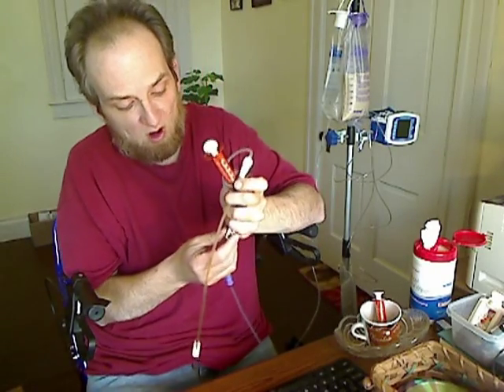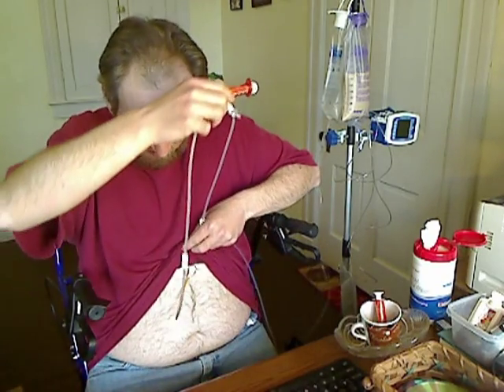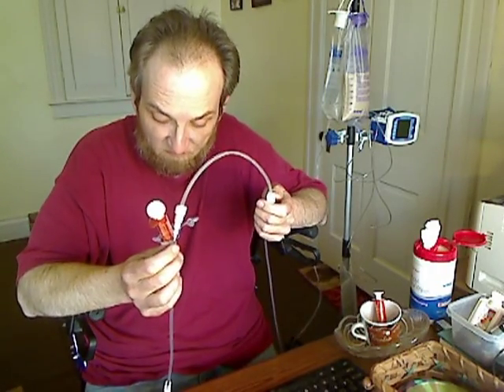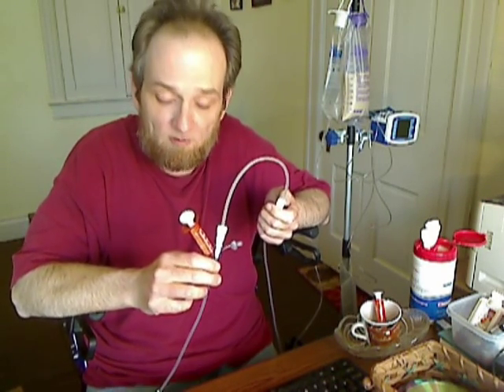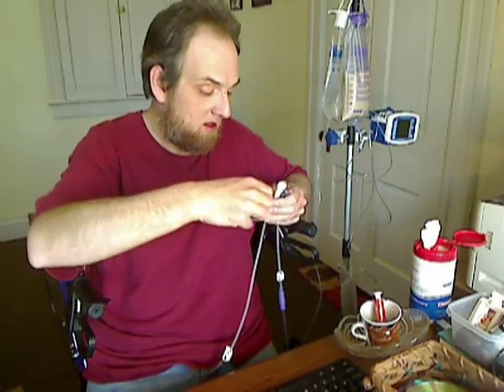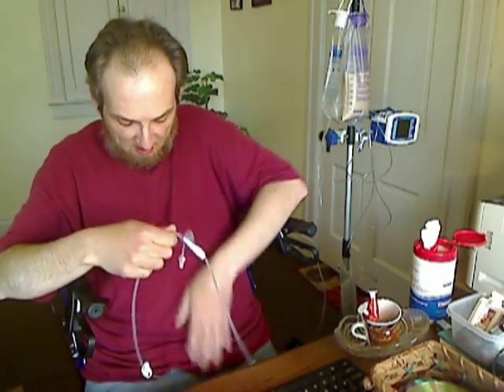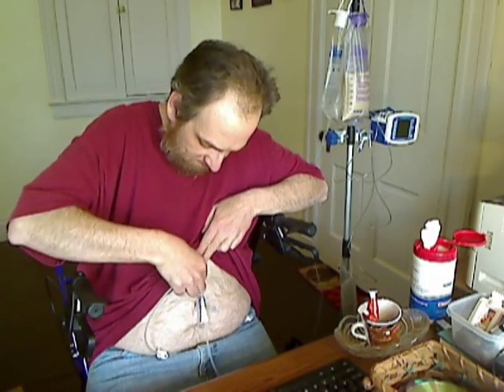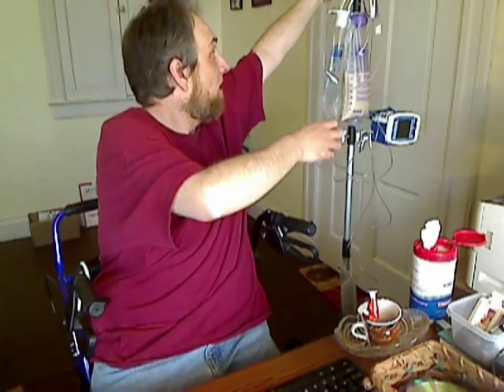Okay, now I'm going to open up my water. And it is done. Just whatever you're comfortable, keeping your hydration, your water limits, so I'm going to let it flush a little more. Okay, so now I've taken two of my medicines. Now I can just simply make sure everything's closed, and I'm good to go. I'm going to disconnect my stomach. I just leave the water bag open since these two clamps close it. And I'll hang it back up on my pole, and I've just had my medicine.